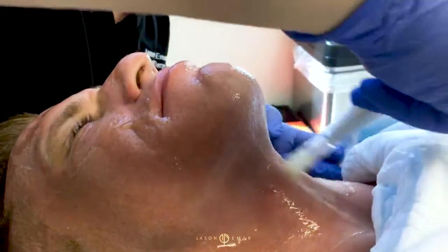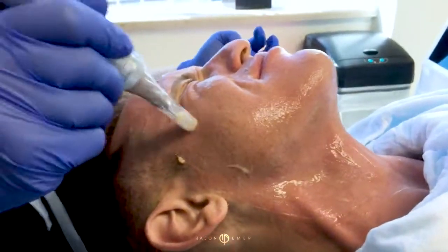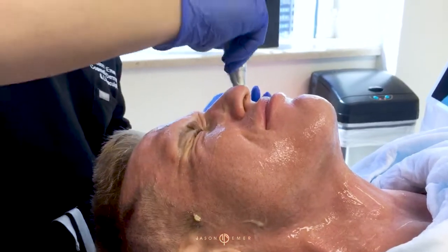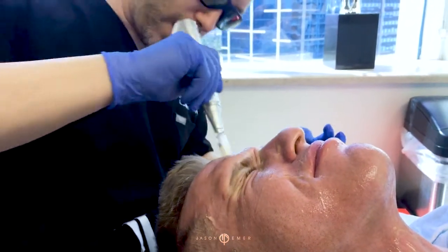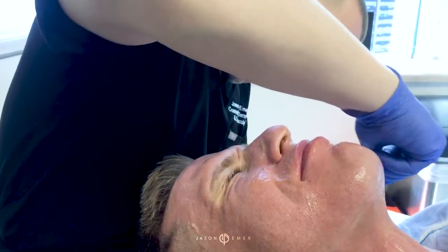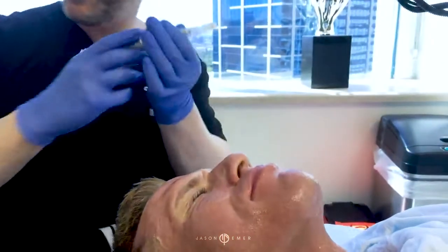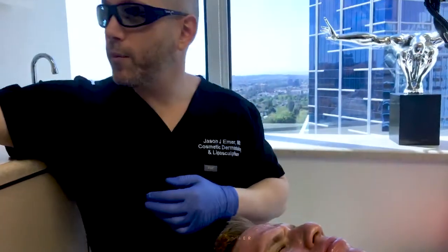Post-treatment, he's been doing this and getting really good success. So this is what we want, and then we need a mask. And then he will put some more stem cells on later tonight, 4 to 6 hours from now, hopefully. One more time with a mask. Do a little stronger on some of these scars. And now we're going to put our cooling mask on top.